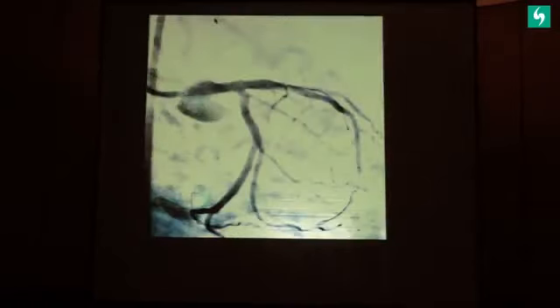Immediately wired, you see a big aneurysm at the distal portion of the left main. And look at circumflex, very big, tight ostial lesion. This patient would not have survived, I'm quite certain about it, would have worsened very fast if he was not in the cath lab. And this is after the stent, and he's doing well.